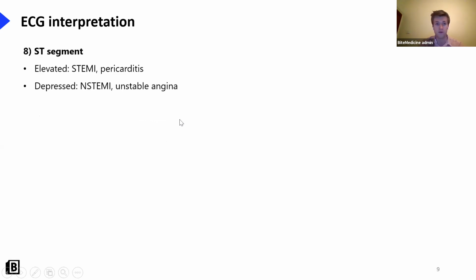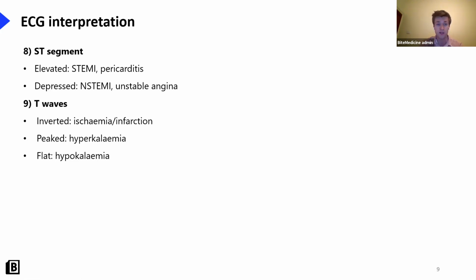And then finally, we've got the ST segment, so that's from the S on the QRS all the way to the T wave. You guys who've attended the acute coronary syndrome session, or have simply been on a ward, will know that the ST segment is really important when commenting on myocardial ischemia and is essential for ACS management. T waves, we won't be covering them today, but I plan to cover them in a future session, so I won't labor the point too much.